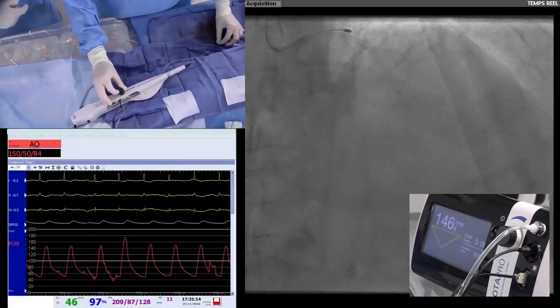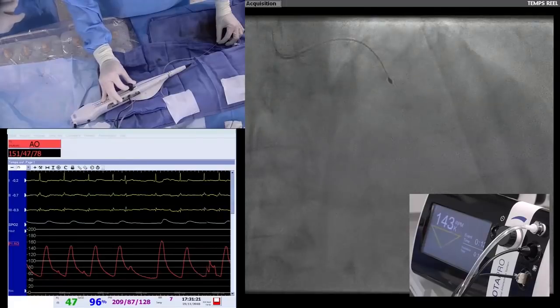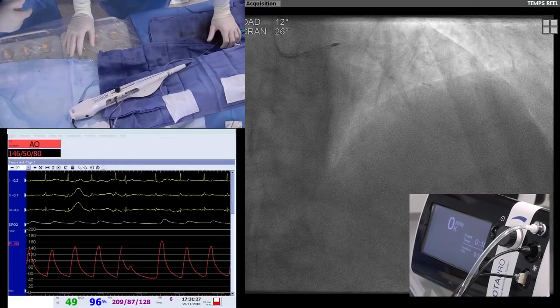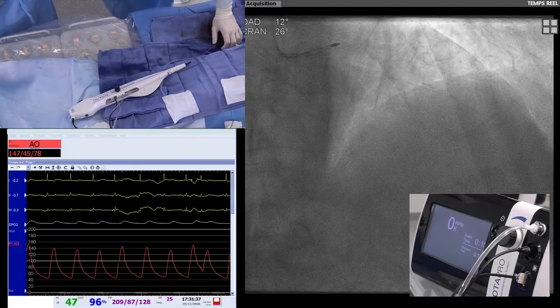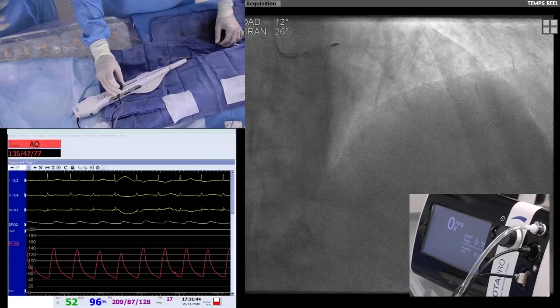In the ostial part, I don't feel any friction. In the proximal LAD, there is friction. Okay, I wait. There is no friction, so I can keep the burr inside the left main. And let me share with the colleagues these tips. There is this nice gentleman on my right who's informing Nicolas about the duration of the run, and he shouts when we pass 10 seconds. That's a very nice trick that I wanted to disclose from the cath lab.